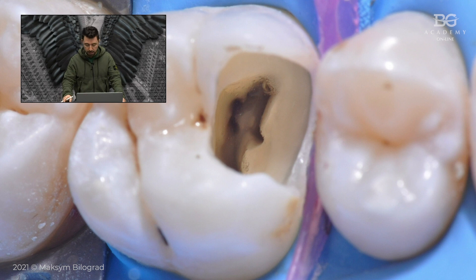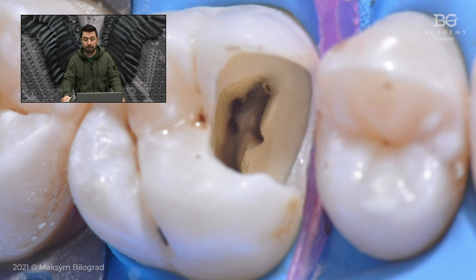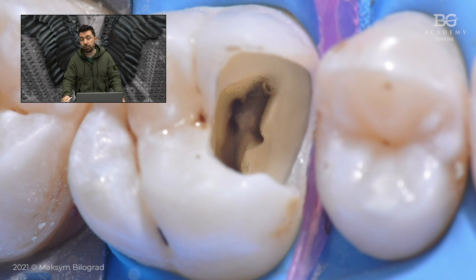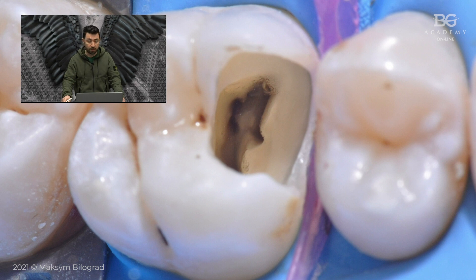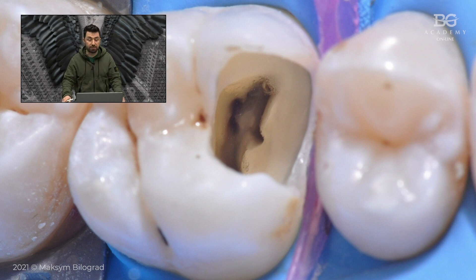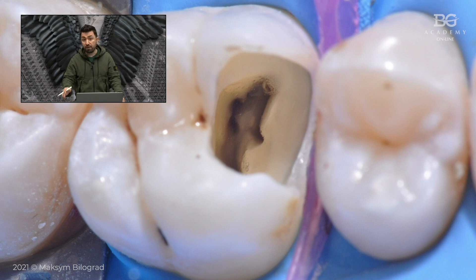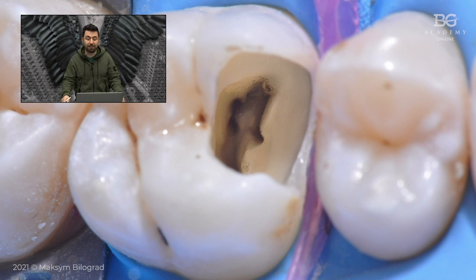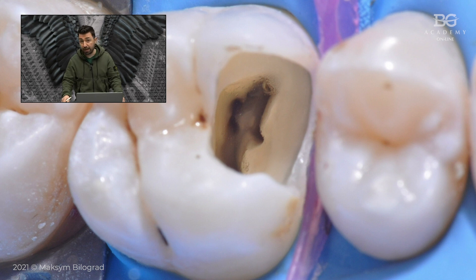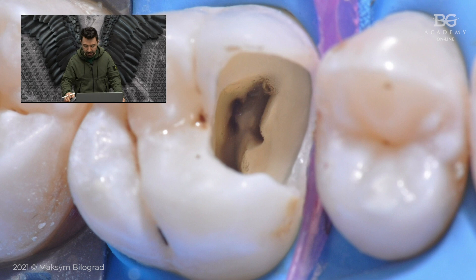For the root canals, I was able to find all root canals and I tried to make my endodontic access as minimal as possible, because I knew that minimally invasive access may help you to preserve very important cervical dentine, which is very responsible for the survival rates of endodontically treated teeth.